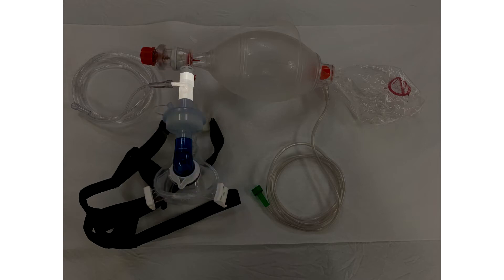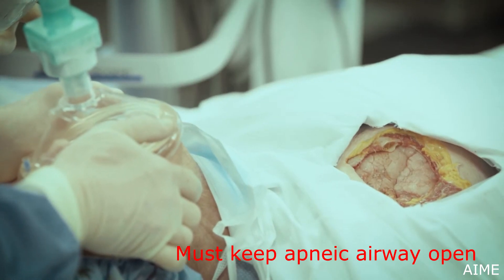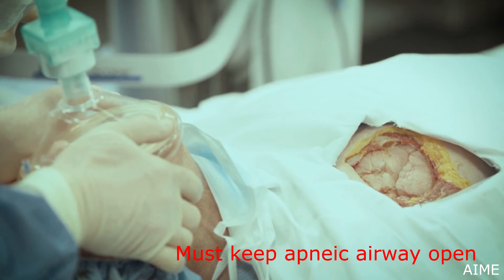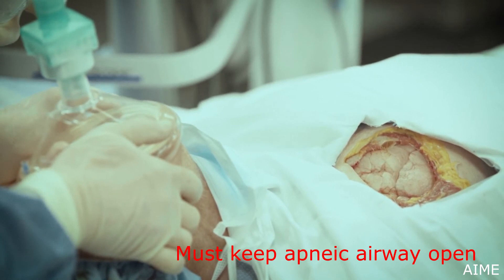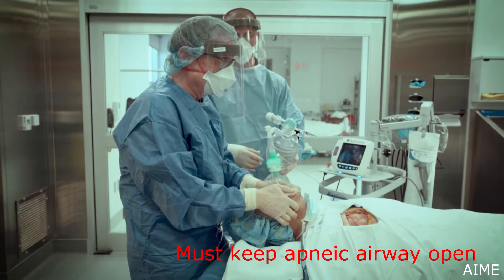This distal source of oxygen is not only crucial for continuous pressure, but also for apneic oxygenation when you need to intubate them. What you're seeing here is an apneic patient. When the airways open, the PEEP causes recruitment and oxygenation of lung. The two things crucial to this are a tight seal and an open airway. There's no bagging needed — this patient is not breathing. You are successfully oxygenating but not ventilating these patients.